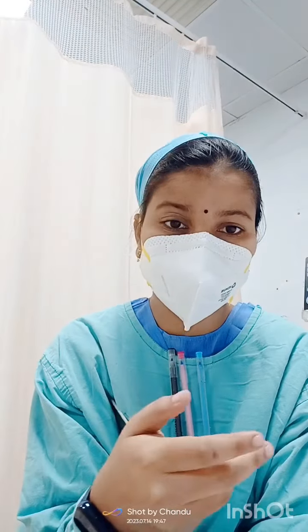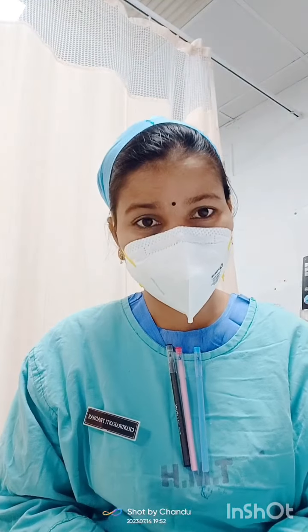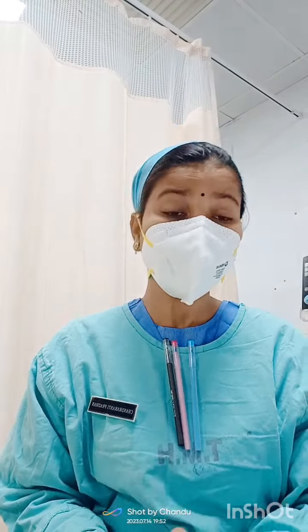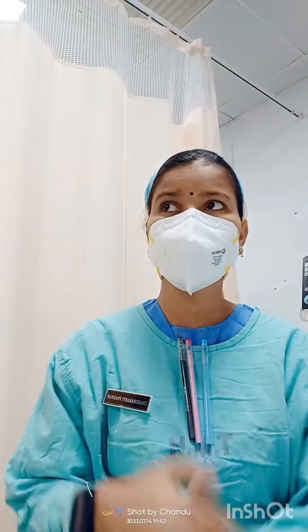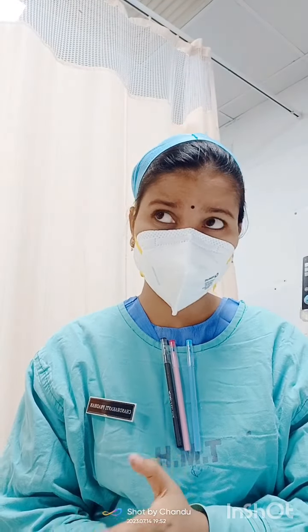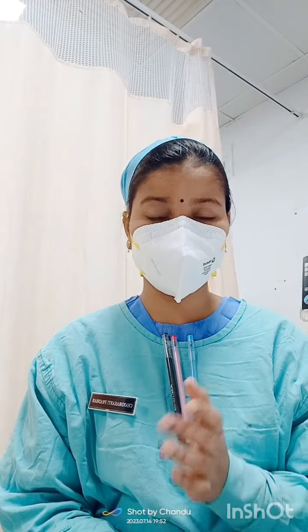There are normally three conditions where we use cardioversion. I will explain how much shock we deliver and how many joules we use, and you have to always remember that. Next comes the energy requirement in cardioversion. In cardioversion we prefer a biphasic defibrillator compared to monophasic, because a monophasic defibrillator uses a higher amount of energy, but a biphasic defibrillator provides energy as much as required.